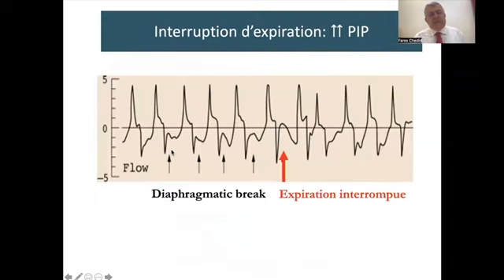We'll see now what interrupted expiration means. You see the patient here is breathing during expiration. There is what's called a diaphragmatic break. He doesn't go smoothly expiring. He doesn't interrupt expiration, but he breaks a little, then he continues expiring. So all of this volume is the expired volume, which will decide the next breath. We have no harm. We have enough volume to decide the next breath. The diaphragmatic break keeps increasing, and we still can calculate all that volume to decide the next breath, PIP.